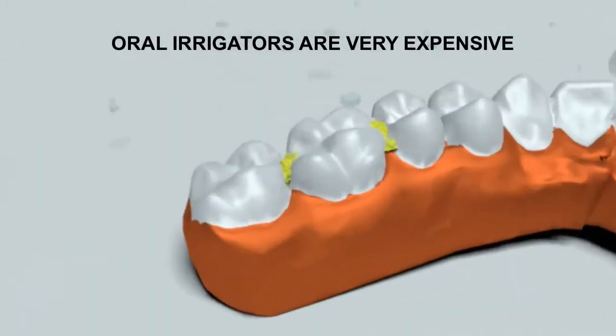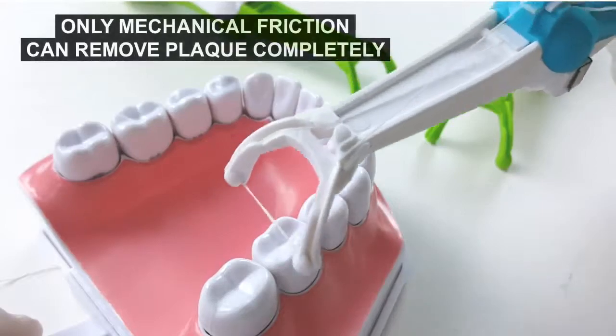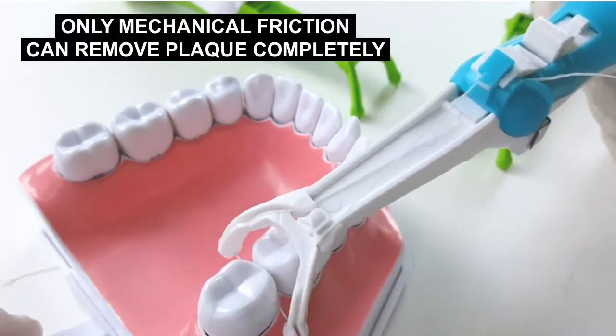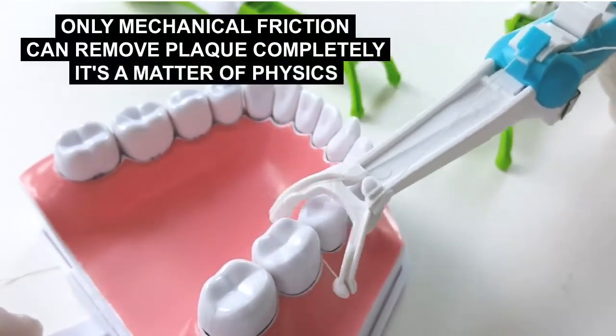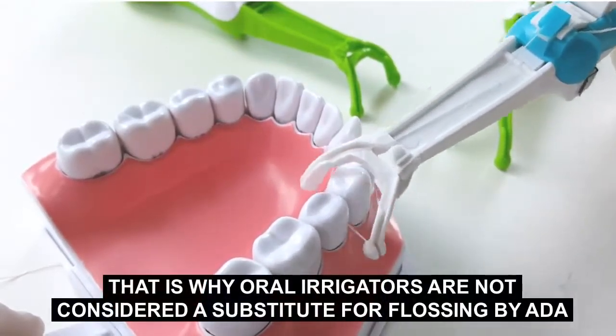Oral irrigators are expensive, and no matter how powerful the jet stream is, it will not remove plaque completely. Only mechanical friction can remove plaque completely — it's a matter of physics. That's why oral irrigators are not considered a substitute for flossing by the ADA.